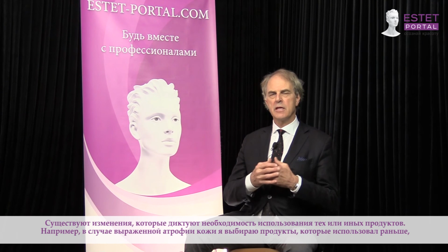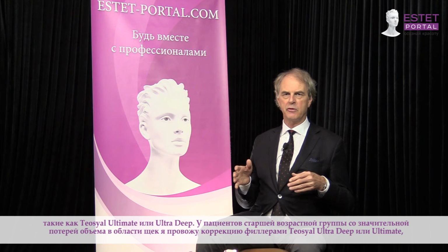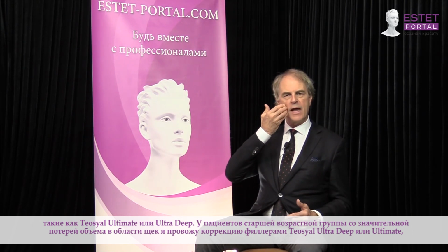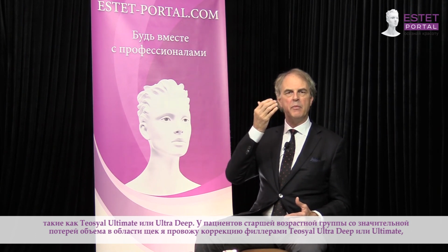The answer is that there are some changes, that there are some products that I find that you want to use when you have severe atrophy of the skin. Then sometimes I will go back to some of my previous products that I used to use, mostly like the Ultimate or Ultra Deep. So in the older age group with dramatic hollowing of the cheeks or the area here, oftentimes we'll put a base of Ultra Deep or Ultimate, just because it's a harder material and I get more lift with it.